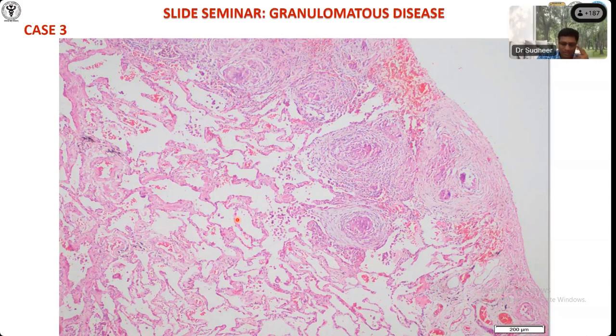You should be very careful. Supposing there is blood in those places, no? Yes. Don't mistake them for cavernous hemangioma or something. Okay? It looks almost like that. The new residents sometimes mistake. Okay. Yes. And one more important thing.